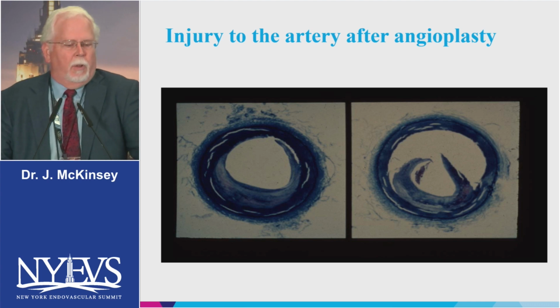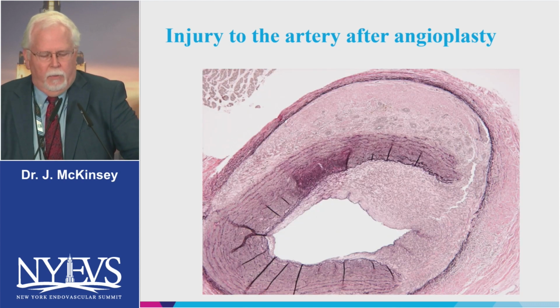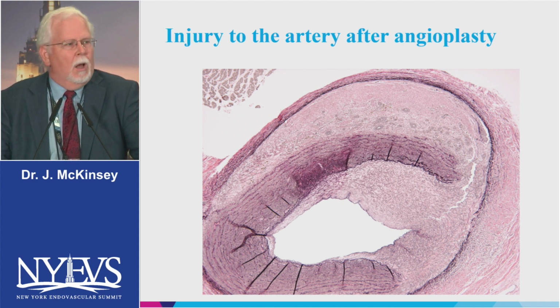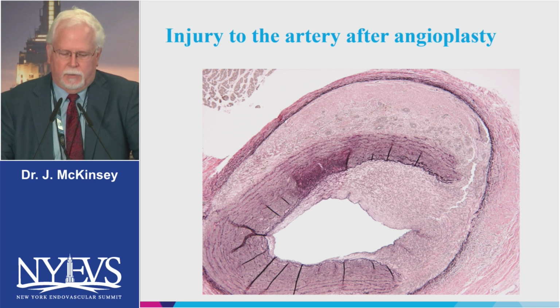And so what is intimal hyperplasia? Well, obviously you see here, this is kind of an early image showing what happens with angioplasty. It's not a controlled stretching of the artery wall, but actually it's a controlled dissection, we hope, as we expand out and many times disrupt the internal elastic lamina. And then the response to that, obviously, is this intimal hyperplastic response that you see, smooth muscle cells and some connective tissue more than anything else. But obviously, you've had complete disruption of the internal elastic lamina and part of the media with that angioplasty.